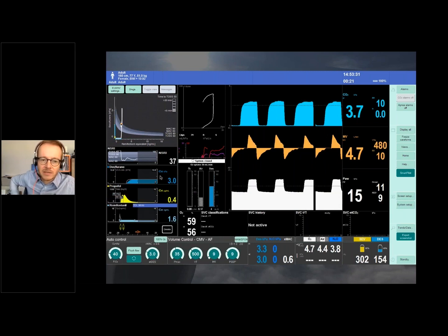And this is after 10 minutes. So now we have a steady target for desflurane. In the meantime, we decreased our effect site concentration for remifentanil a little bit. Propofol is almost gone. We are here, the orange dot. Again, we have a slightly higher NSRI than expected, but this lady had a BIS value at this moment of 42, so I think it was good for her. And we are working with 2 targets, so if we don't change anything, our predicted anesthetic depth will not change either. That is why the orange dot, the black dot, and the arrow are all on the same spot.